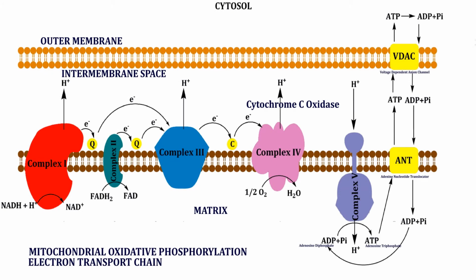A word about quantum effects. Laser light and LED light are both used for LLLT therapy, but laser light is acknowledged as having a better effect. It penetrates body tissue to a greater depth, and it affects mitochondria to a greater extent. The latest theory for this is that because laser light is coherent, it causes quantum coherence in the cells and thereby initiates quantum superposition and quantum tunneling. This increases the rate of photon and electron transfer, upregulating cytochrome C oxidase.